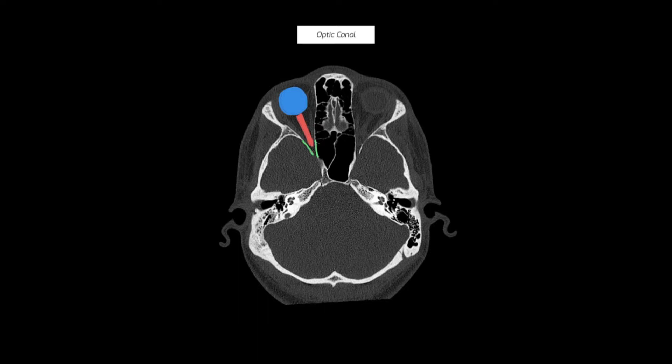In blue, I've highlighted the globe, and from the posterior aspect of the globe, as indicated by the red cylindrical slash rectangular structure, you can see the optic nerve heading towards the orbital apex. The optic canal forms the end of the orbital apex and is highlighted by the green lines.